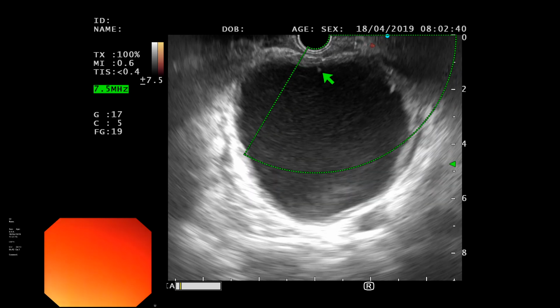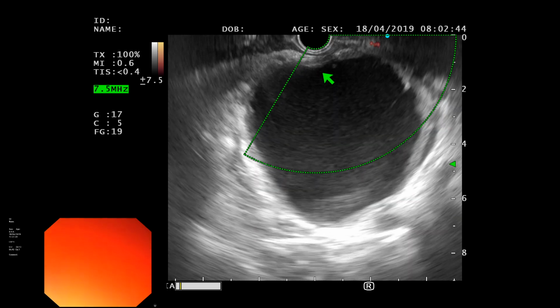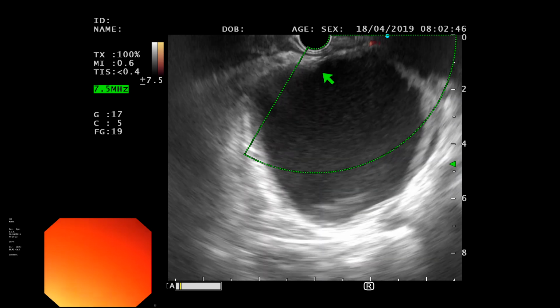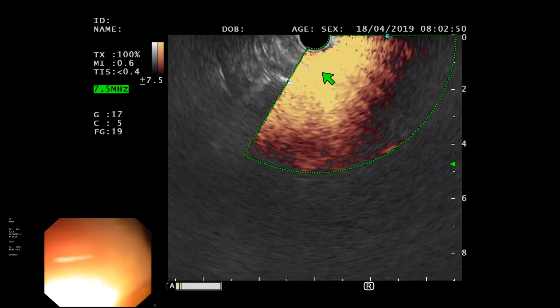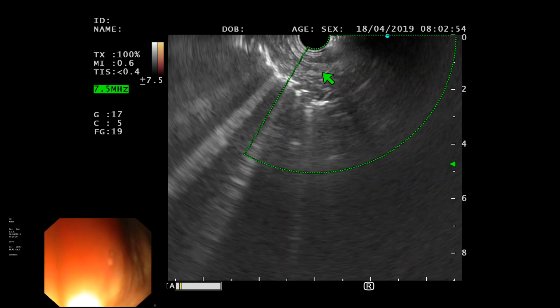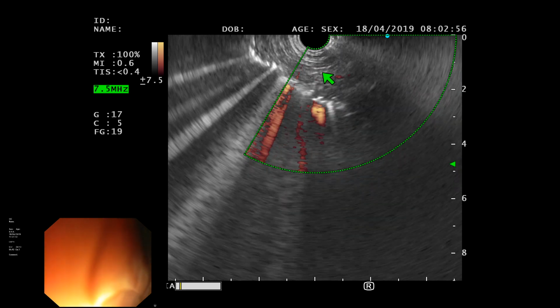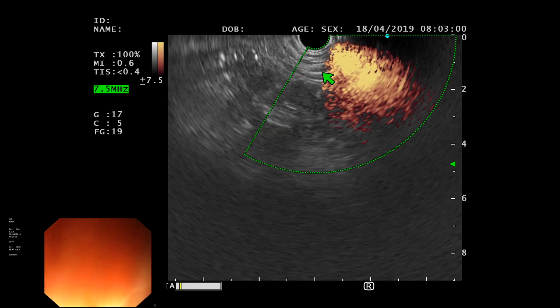You're looking at 5 structures. I mentioned those. You're looking at the aorta right in the center. If you rotate to the left from the aorta, you see the IVC and right kidney. And when you rotate it to the left side, you see the uncinate process, the bile duct and the pancreatic duct, and from there you follow them back. So let me just come back.